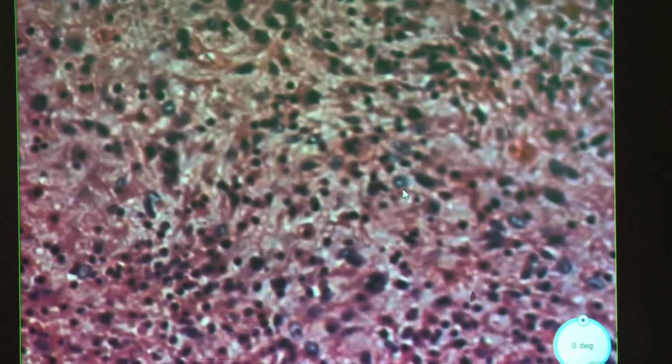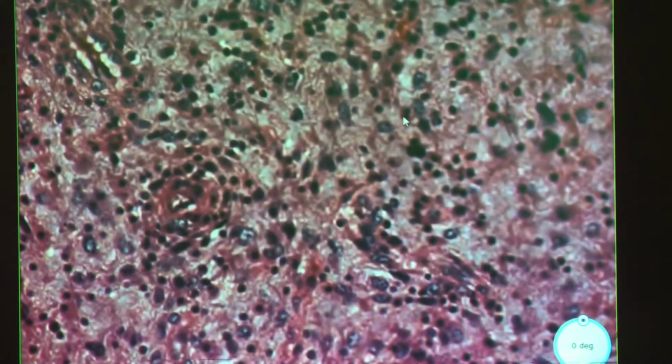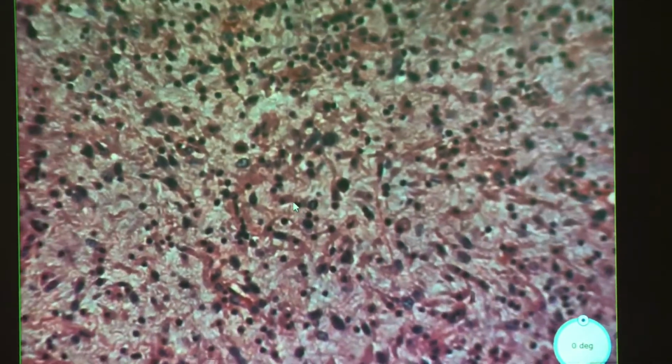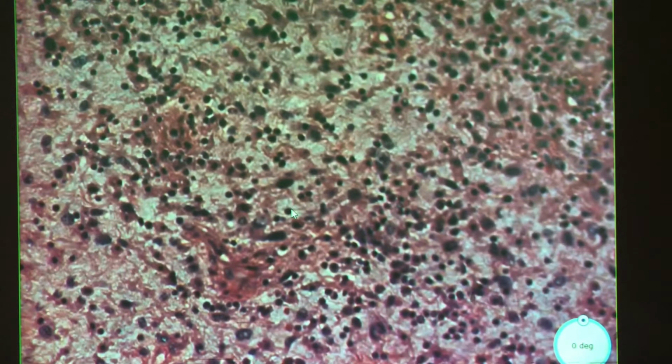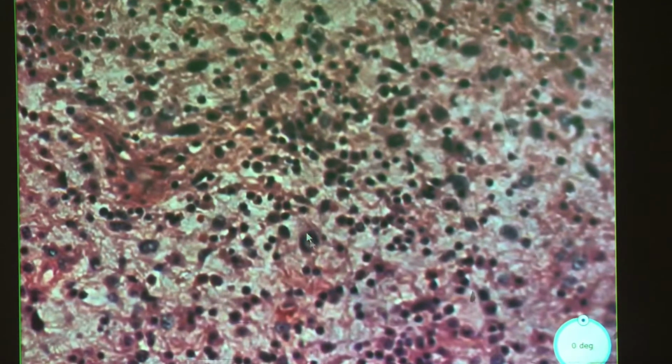But it looks like maybe we have some pseudo-inclusions like we were seeing before, but it's really hard to tell. And some of these cells maybe start looking a little more spindly, but they're relatively plump overall. Look at that guy, it almost looks like a jelly bean. But okay, so not a whole heck of a lot to go on. That looks really funny. Almost like quotations.